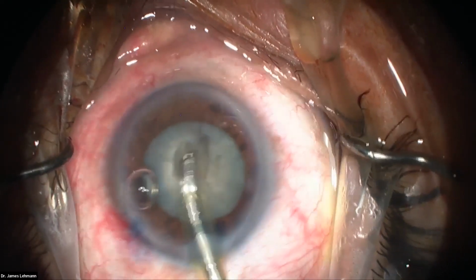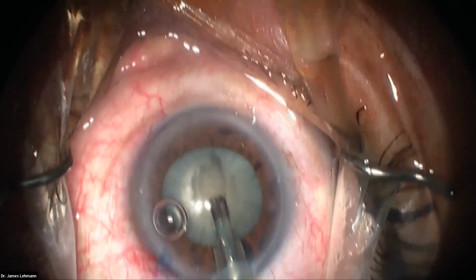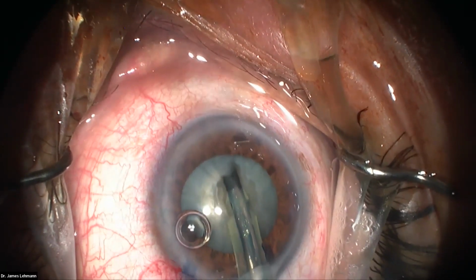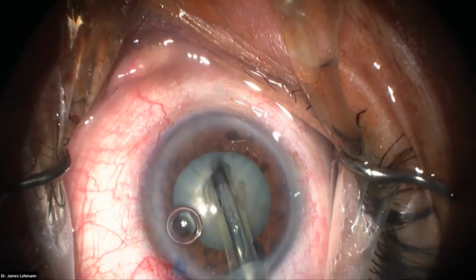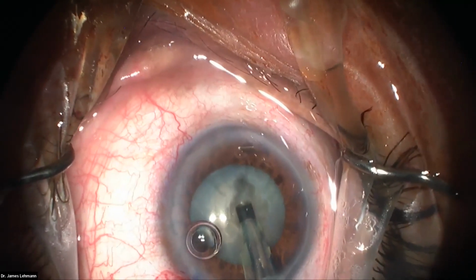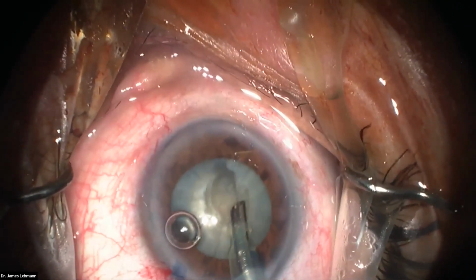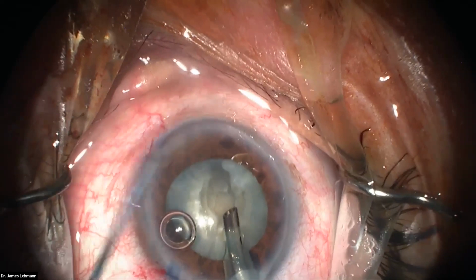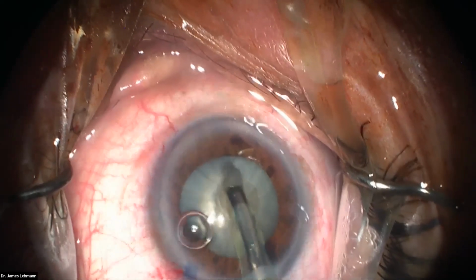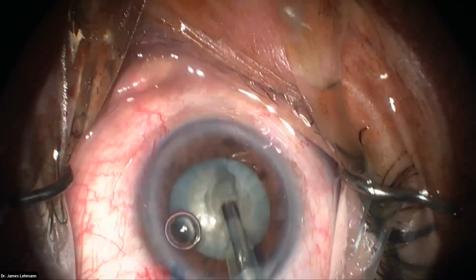Oh, I'm going to clear a little of the viscoelastic there to improve y'all's view. And then I'm going to keep going. Now I'm only using phaco power on the way down. And I want to kind of see the edge of that groove. And how deep do I go? This is kind of a good question. You really won't see a red reflex in this situation, but you go down till you start seeing a change. You can see that looks slightly different down there at the bottom. If you start to see little lines going perpendicular to your phaco tip, you know you're at the right depth. So I think I'm at the right depth there. I'm just going to go a little more here centrally. All right, so now I think I'm about 80%.